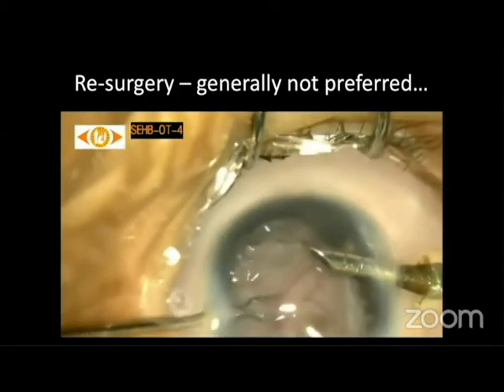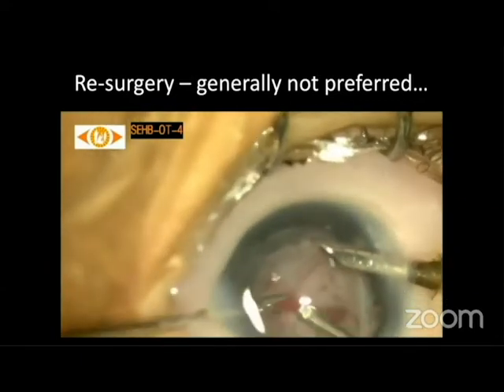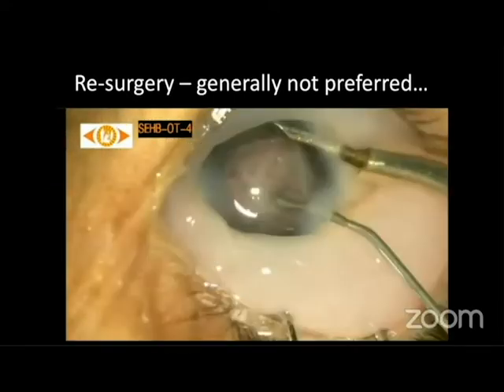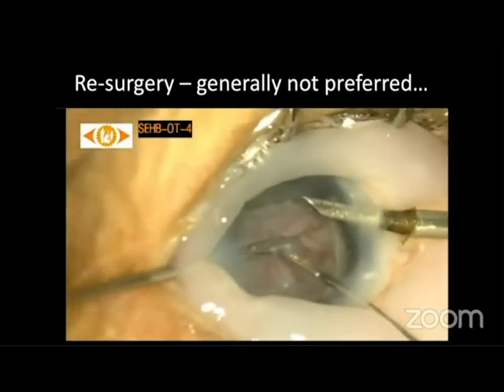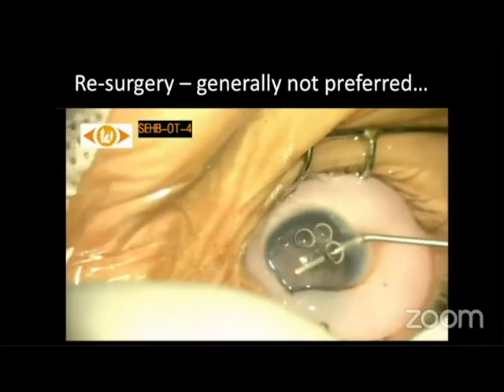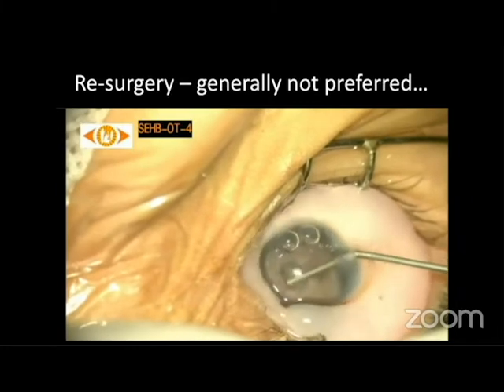Sometimes we leave behind tissue posteriorly because we are not able to access it safely during the primary surgery, waiting for the retina to open further before we go ahead with the subsequent surgery. So here you can see that some tissue which was left behind posteriorly is being dissected now, along with anterior dissection of the recurrent tissue, and we leave behind viscoelastic to open up the funnel.